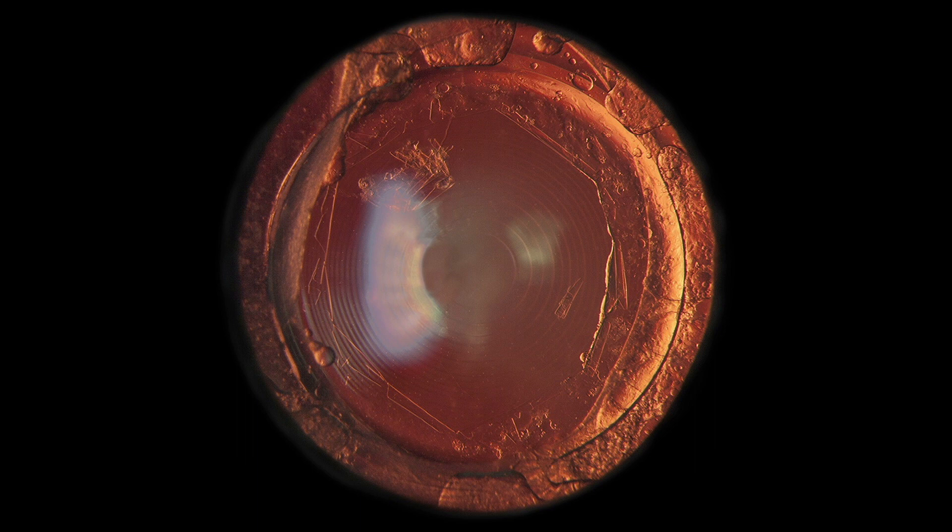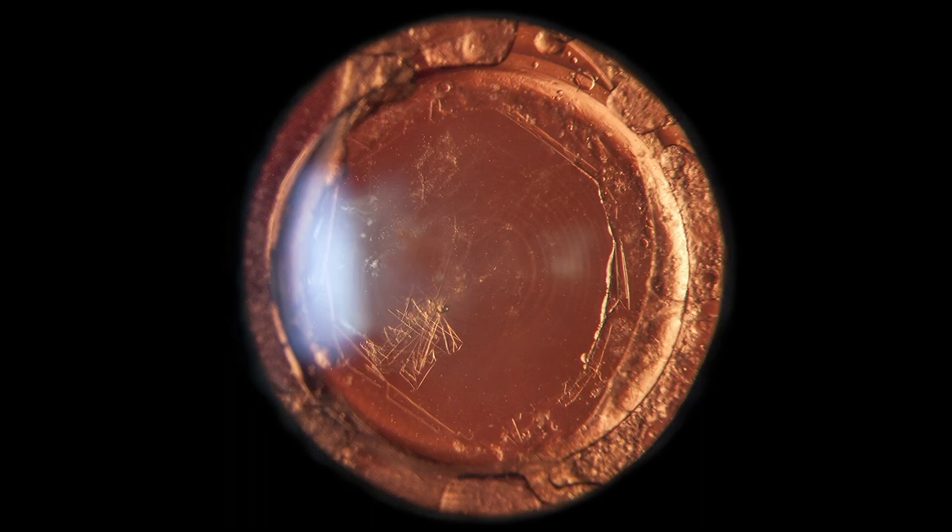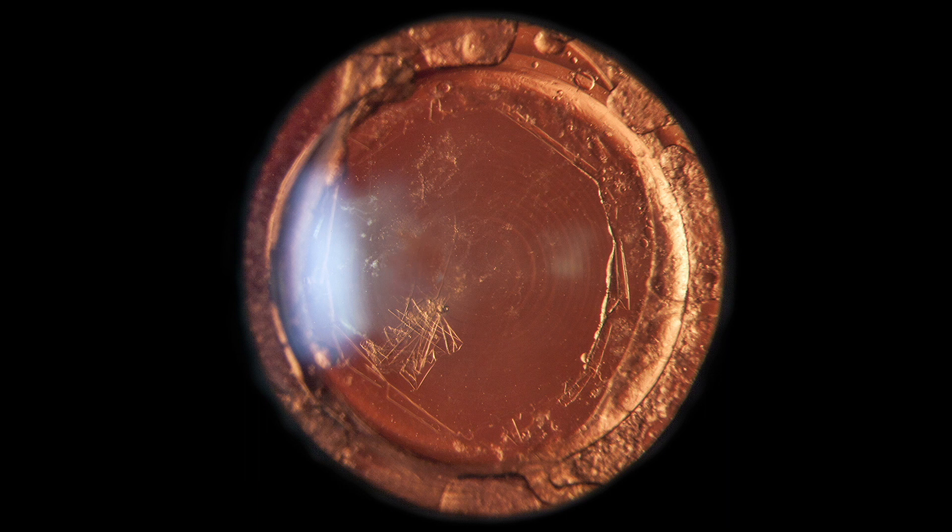The freed capsule lobe is left to float in the vitreous body. It is not uncommon for this to remain in the area of the optical axis, fully oscillating with all eye movements. Fortunately, not all patients will perceive this capsular remnant. However, some will be severely impaired by it, as you can see in the following example.